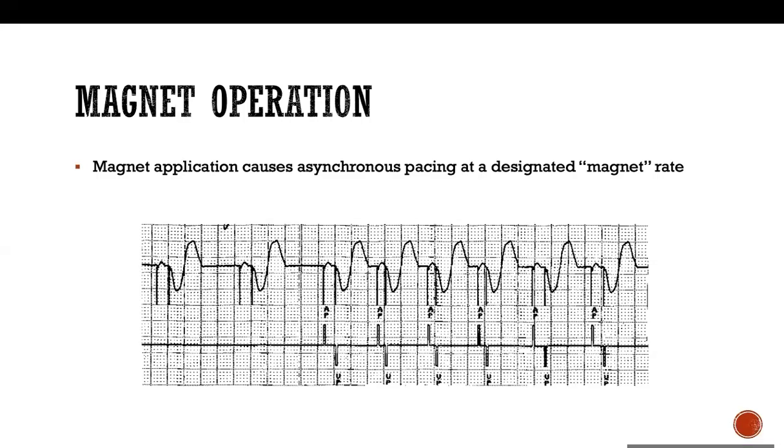Okay, so the magnet in an ICD works differently. So one, it inhibits therapy. So for example, this patient is going to the surgery. If you use cautery, the device is going to see it as noise. It's going to be very close to each other. So it might count it as ventricular signal and might diagnose it as VF and might give inappropriate shock. So you want to disable therapy so the patient will not get shock from noise from the cautery. Okay, so this is the different thing.